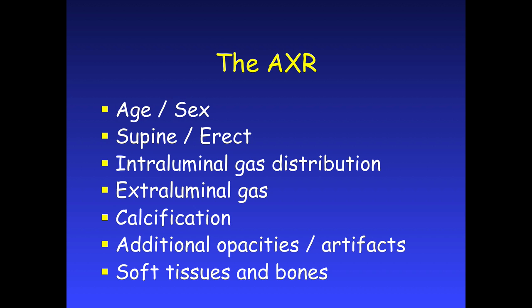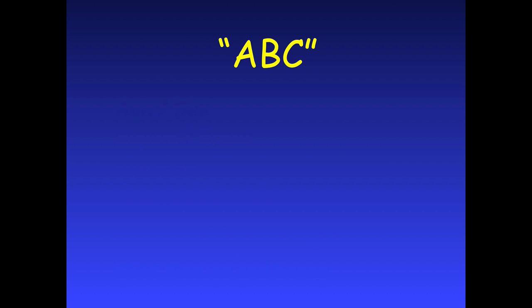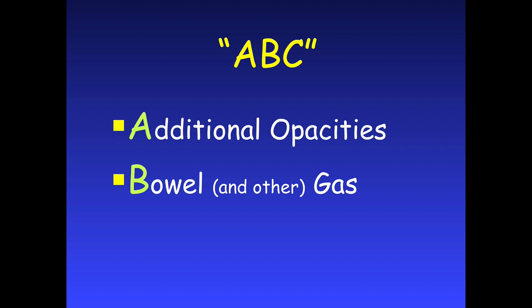The age, sex, and supine or erect position will be written on the film or given in the history. The main things on an abdominal x-ray are the luminal gas pattern, extra-luminal gas, calcification, and additional opacities or artifacts. We like to use the ABC mnemonic: A for additional opacities, B for bowel gas pattern or extra-luminal gas pattern, and C for calcification — easy to remember.